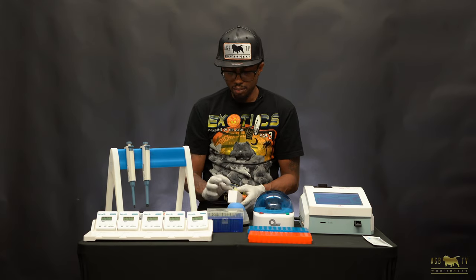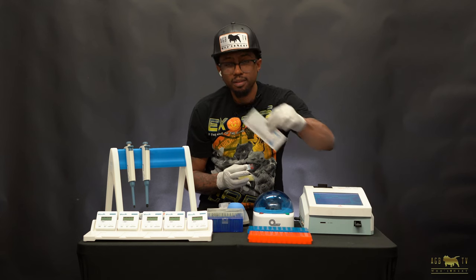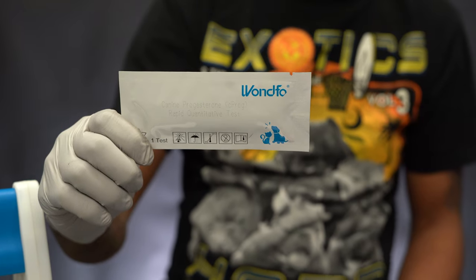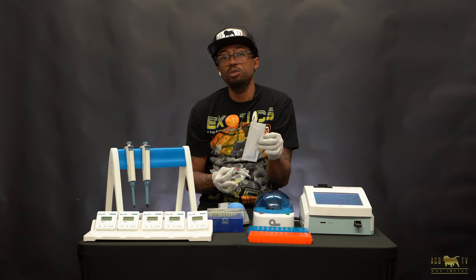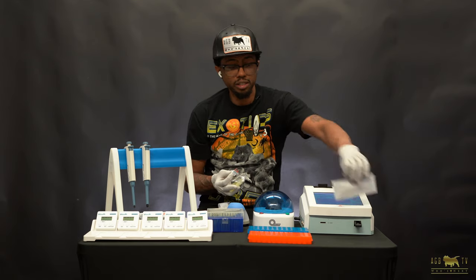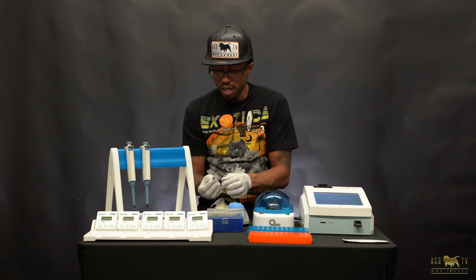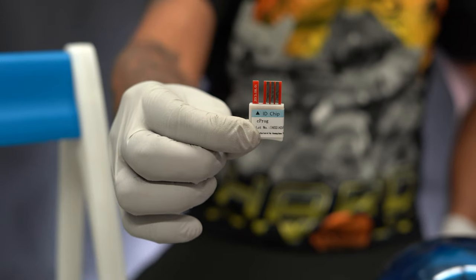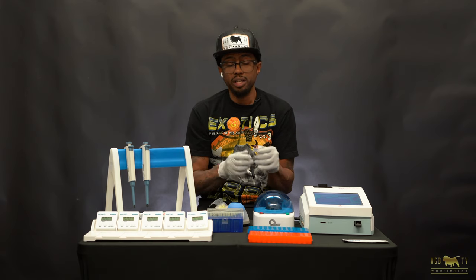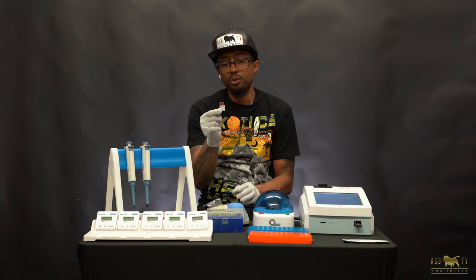Anytime you order test kits for this machine, it comes in a box with 10 of these — the actual Wunfo test strips. You want to make sure these are sealed. The great thing about the Wunfo is that these do not have to be in a refrigerator. You can leave them at room temperature and they can last up to a year or two. Every test box comes with a chip, and the machine itself doesn't have to be manually calibrated — the chips that come in every box are calibrated for you.